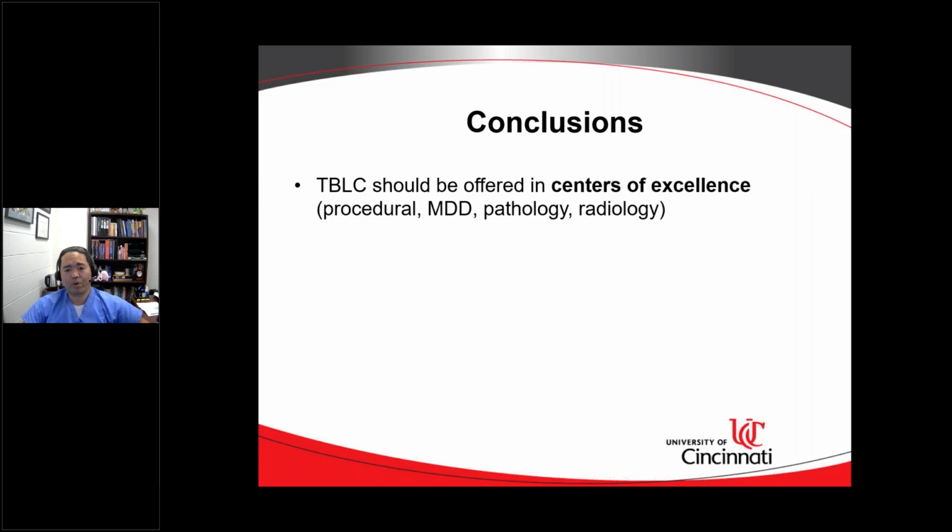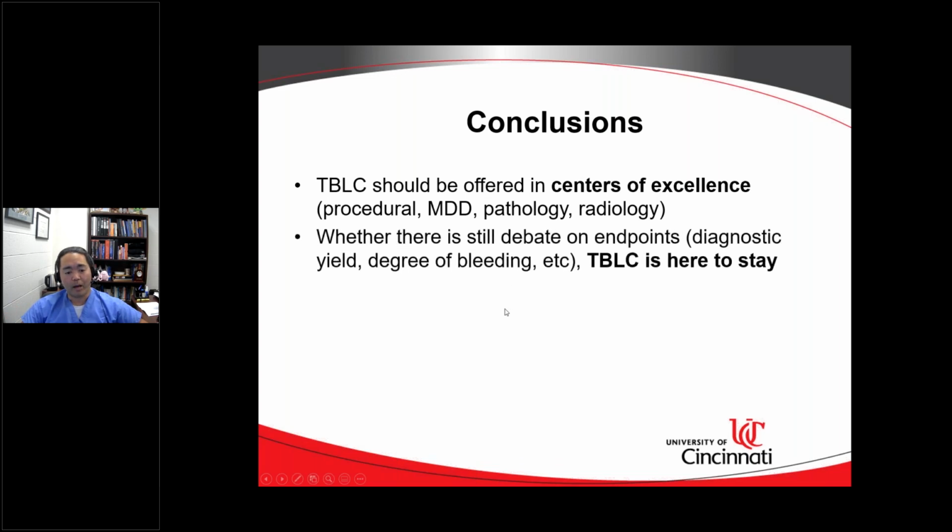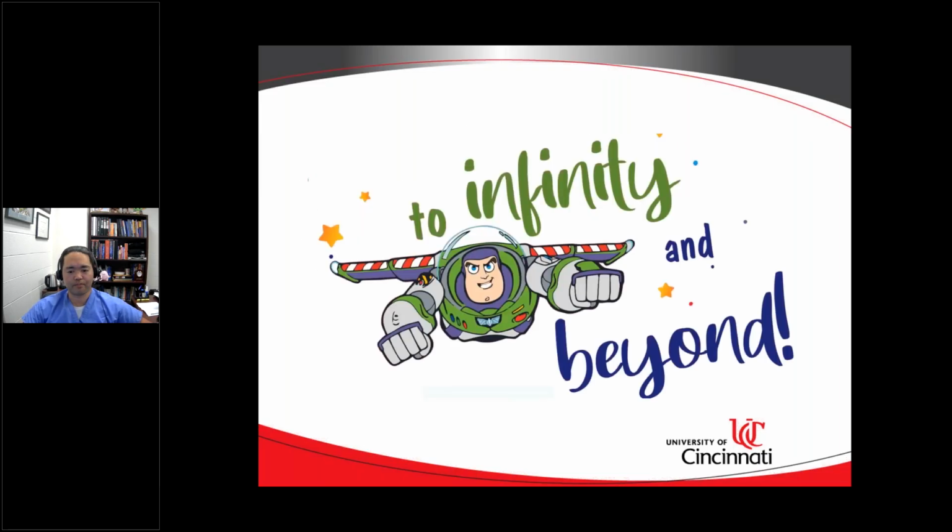You actually have to have a great framework for which you're going to have a better outcome in terms of diagnosis, treatment, and prognosis for your patients. And again, whether there's still debate on endpoints, diagnostic yield, degree of bleeding, anything else, I think cryobiopsy is here to stay as a diagnostic procedure for ILD and other applications.